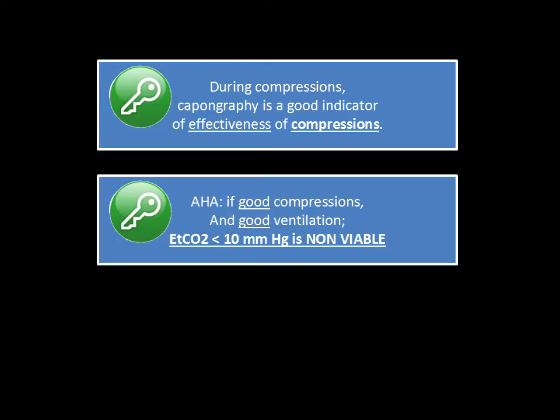In American Heart, if you're doing good compressions, you're not over ventilating that patient and blowing off too much carbon dioxide. So your good compressions, good ventilation, but your end tidal remains below 10 for a period of 15 to 20 minutes.